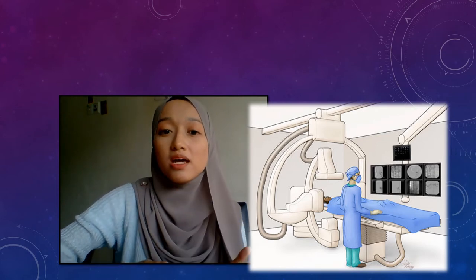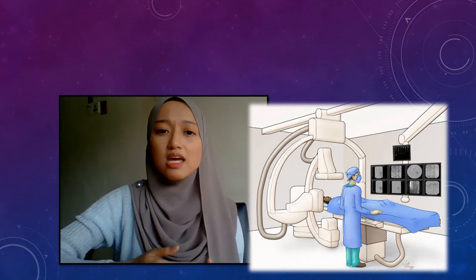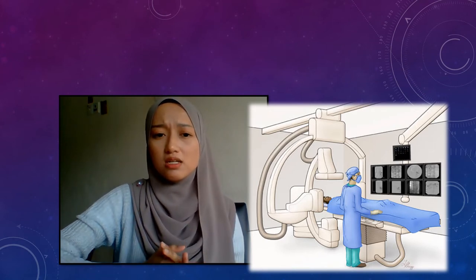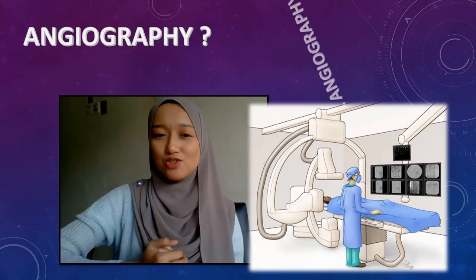help your doctor prepare a safe removal of a tumor located near many blood vessels, as well as show the location of normal blood vessels in the area. But what is angiography and spinal angiography?